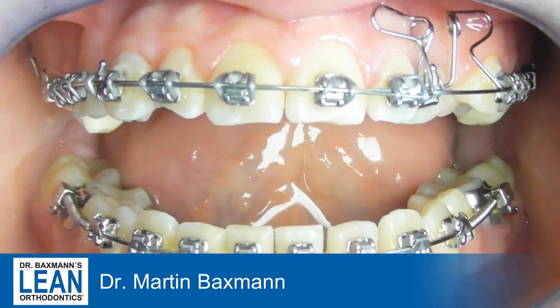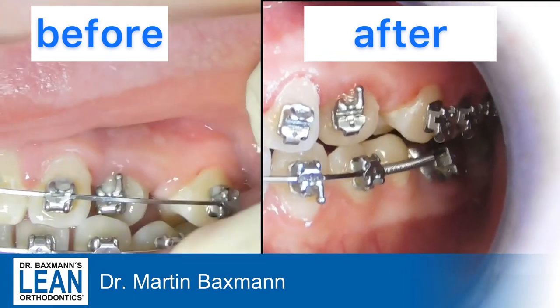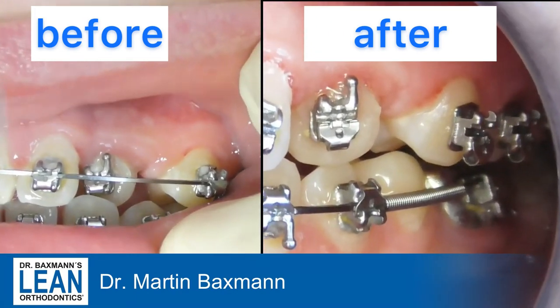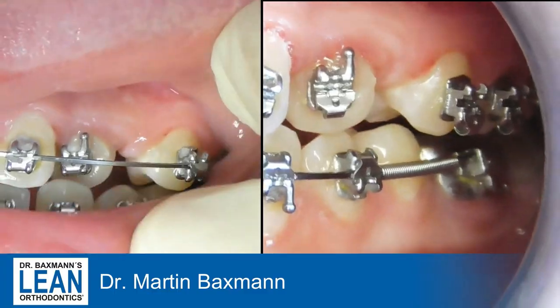Don't forget the bite blocks on the molars to allow that kind of movement and to be on the safe side. After about six weeks, the tooth has come forward nicely to the outside and crossed the occlusal plane already.